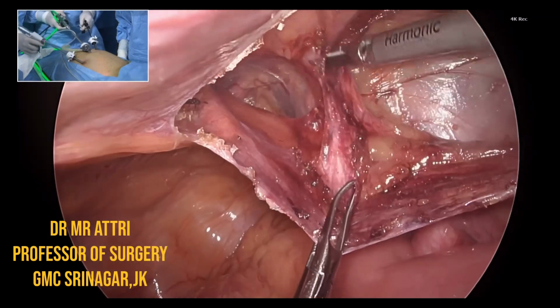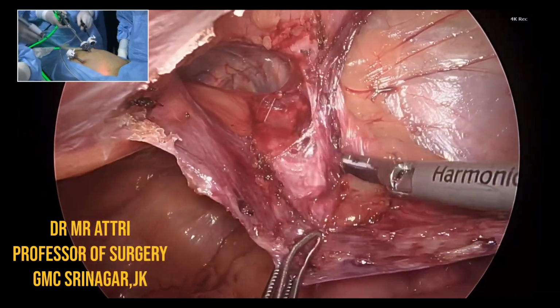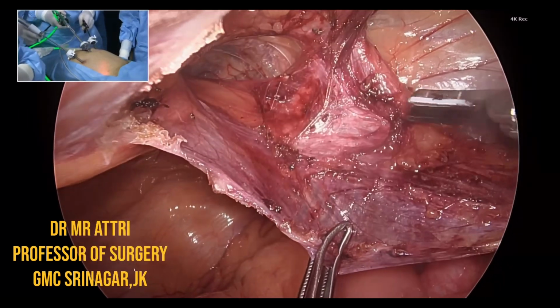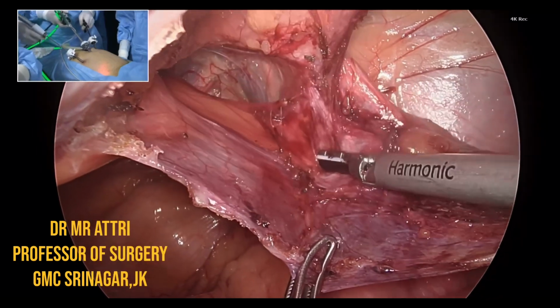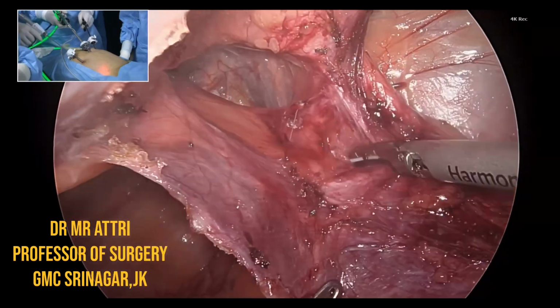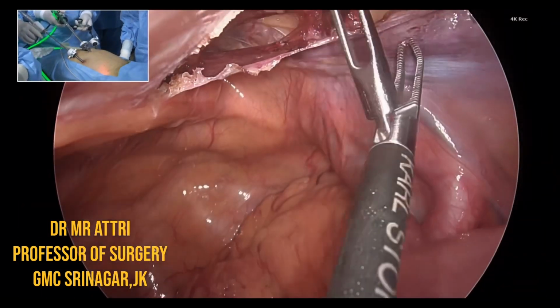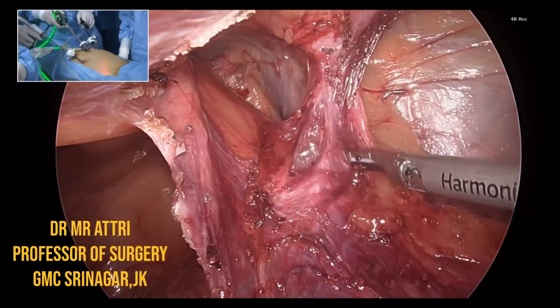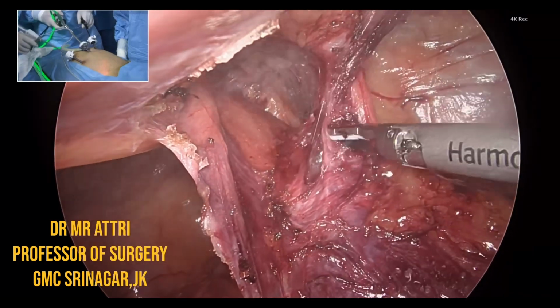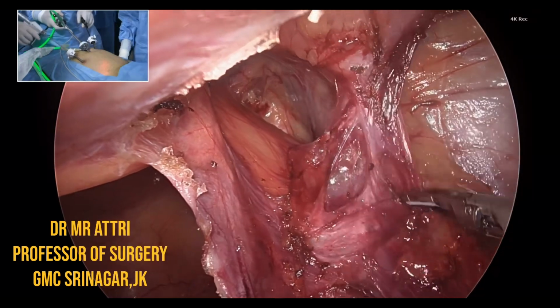Now, we have marked the bony margins. You can see this is the anterior superior iliac spine here, right? That is the anterior superior iliac spine. And this is the pubic bone. This is the midline, which should be the linea alba, because the patient is in a slightly tilted position, so it's coming here. This side, apparently, looks to be the mid-clavicular line. And this is the scar area where there is a hernia. You can see that there is the incisional hernia.